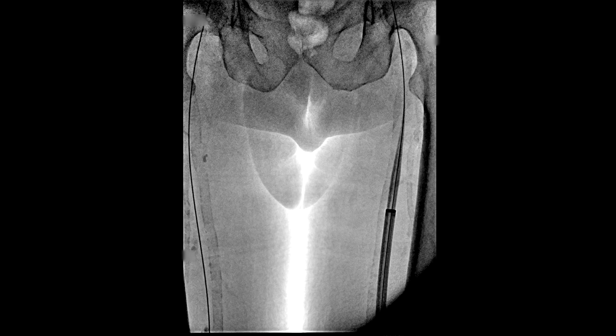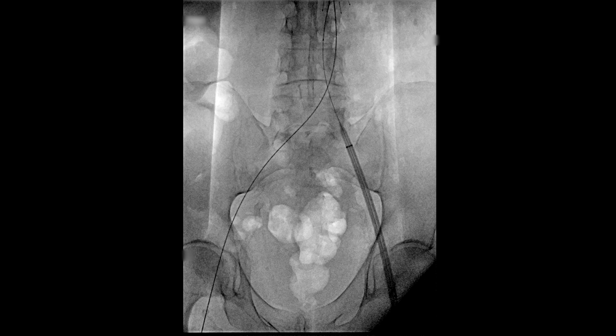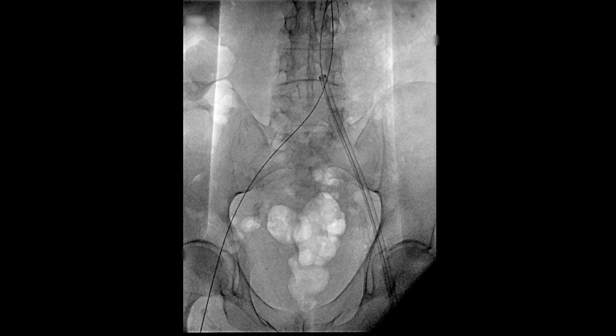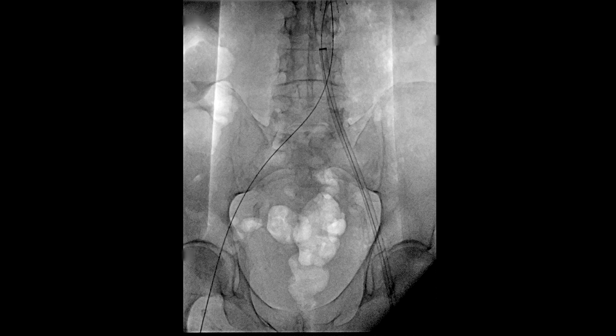This is a T20 flow retriever from Inari Medical. You can see it advancing first through the femoral veins and then through the iliac veins and up into the inferior vena cava just below our filter. After this is in position, we remove our dilator and we are able to then start our thrombectomy.